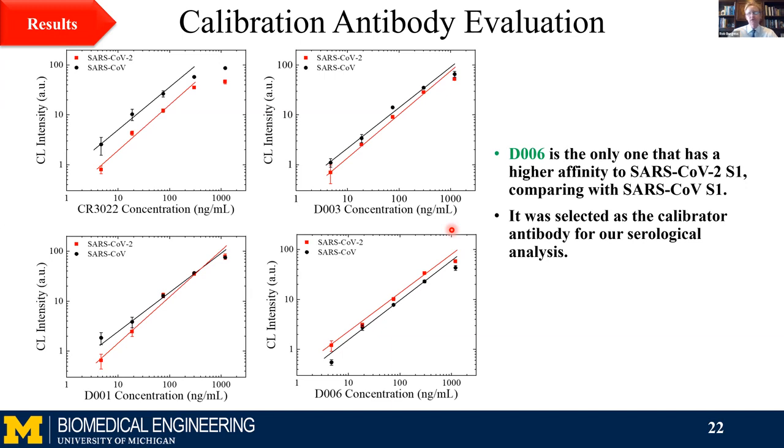So let me ask a question. I mean, obviously you focused on coronaviruses, not just COVID-19, but another one. Have you studied any other types of diseases using the system? Not really. We never applied our system into a clinical study before this COVID-19 pandemic. But we did some measurement with animal models of cancer, for example, bladder cancer. We had a recent publication regarding using a urine marker concentration to model the progression of bladder cancer.